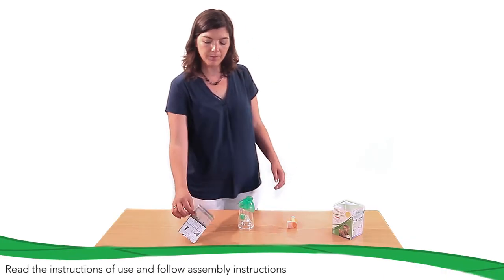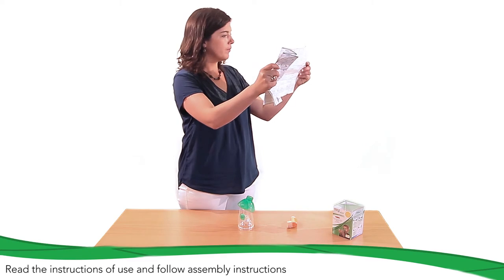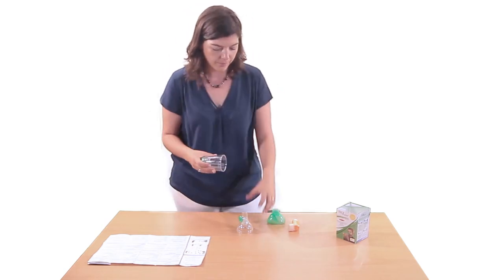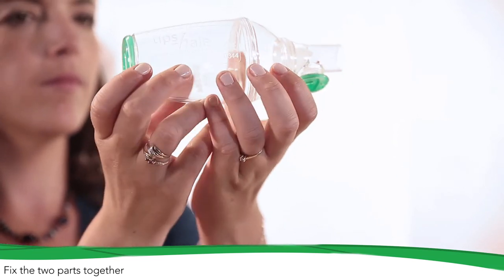Before using it for the first time, please read the instructions of use supplied with the valved holding chamber and follow assembly instructions. Fix the two parts together and check they are correctly fitted.